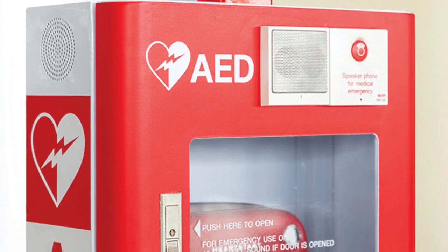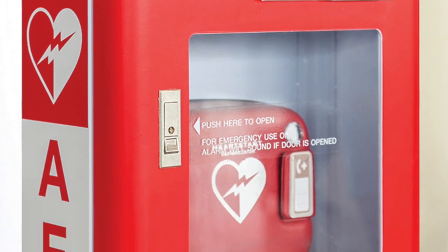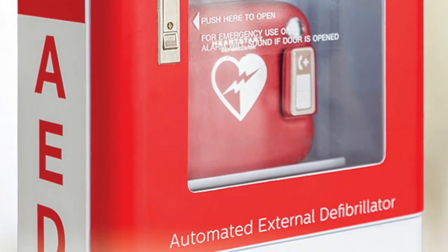When a heart stops, it needs to be jump-started. The AEDs will provide that electrical impulse to restart that heart. You could find AEDs across the city. It sounds complicated but it's not, and we're going to show you how to do it.